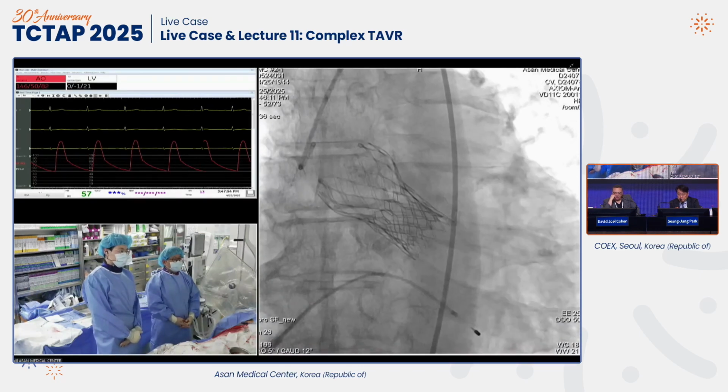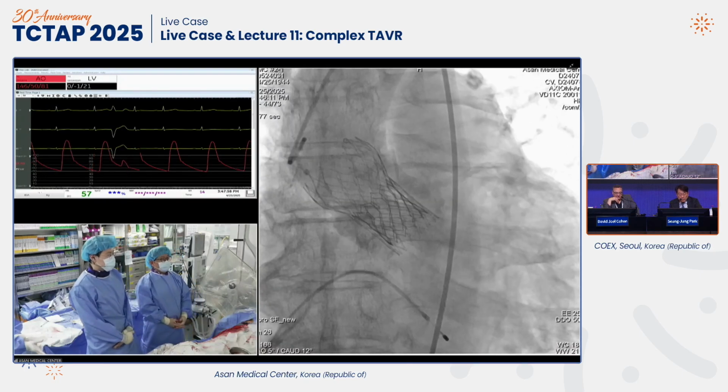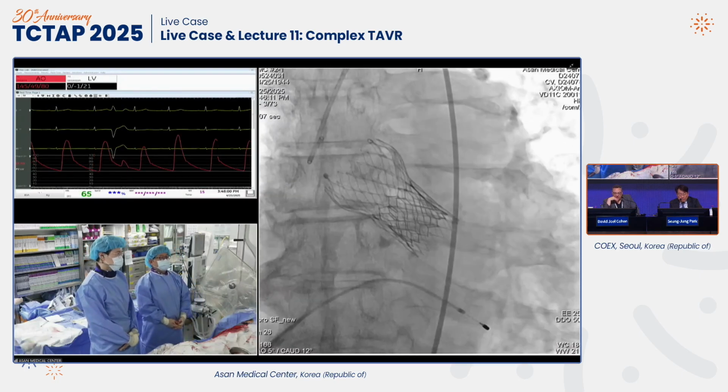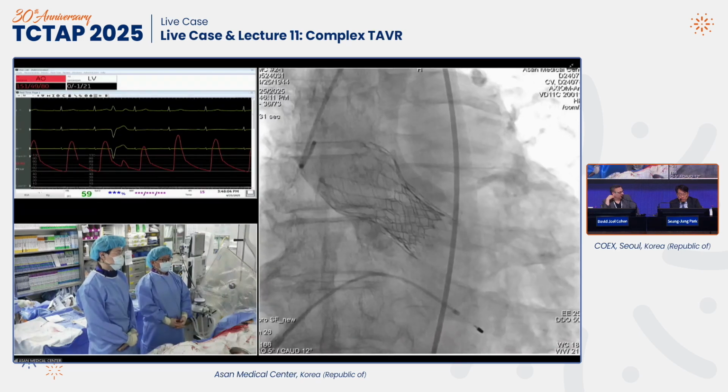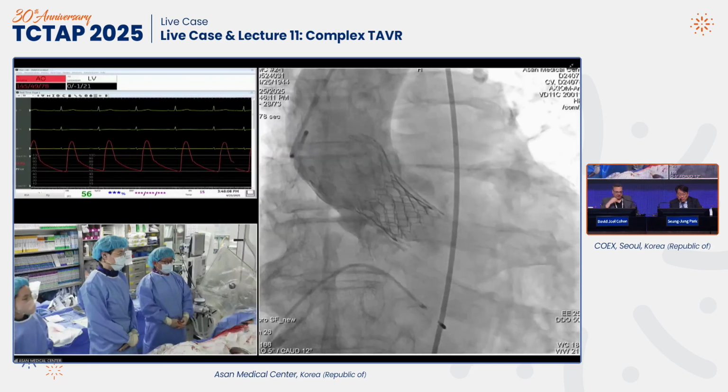I think that what we're learning, what we know, is that planning is the key to success in all TAVR procedures, but especially in these TAV-in-TAV type of procedures. Great. Thank you so much, Jung-Min. David, thank you, SJ.